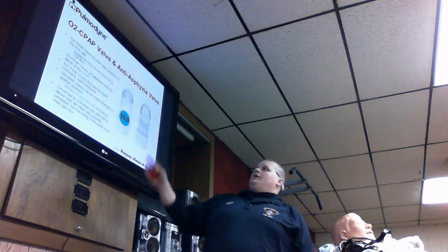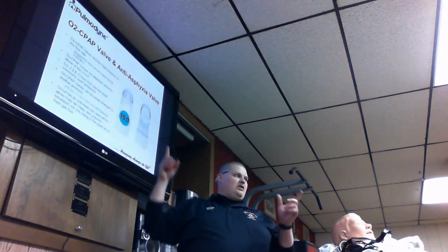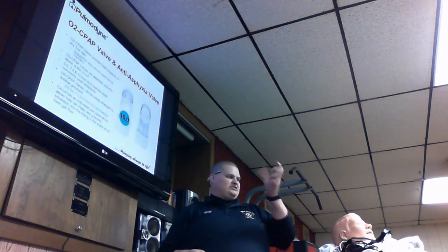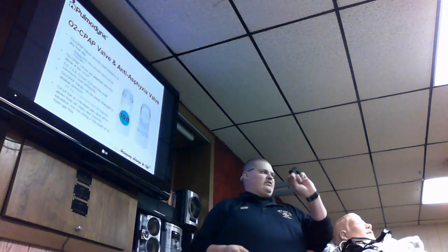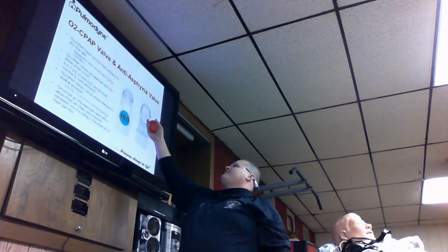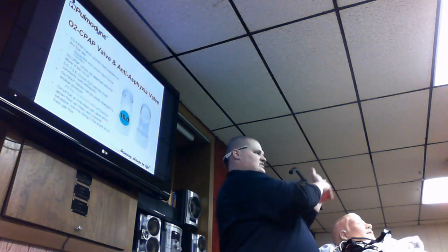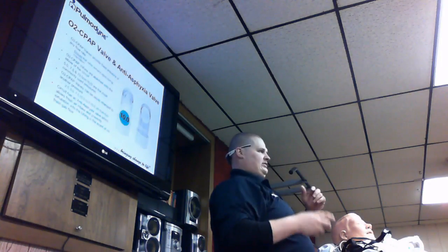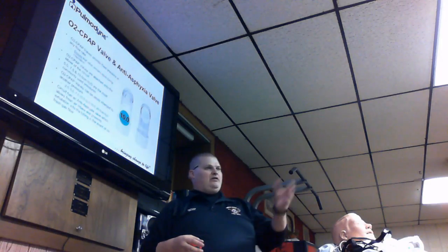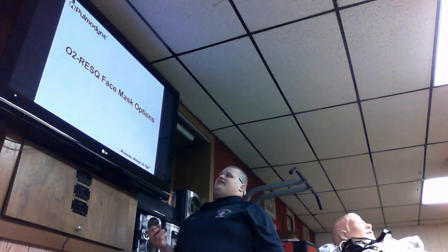Moving forward, it's got a valve where you can set it up to your pressure. We start ours out at 5, and ours isn't exactly like this one with the 10. Ours you can actually dial down. It starts at 5, goes to 7.5, and then 10 right after that. It's got an anti-asphyxia valve, so when the patient's breathing in and they go to exhale, it goes out the side, so you're not rebreathing anything. So it kind of works like a non-rebreather. It's got a little flappy valve on there, so you don't have to inhale that expired O2 that you just exhaled. So it's got different options for us.